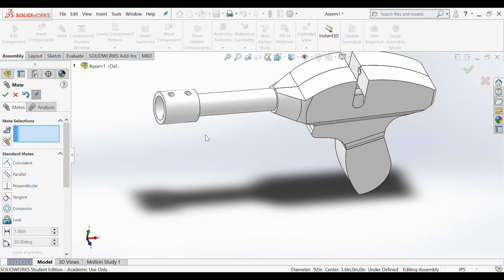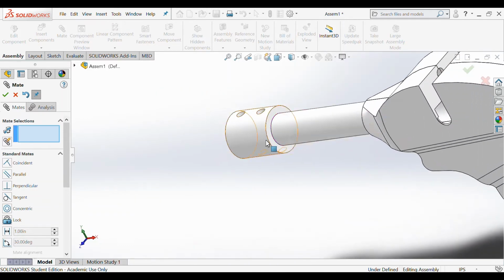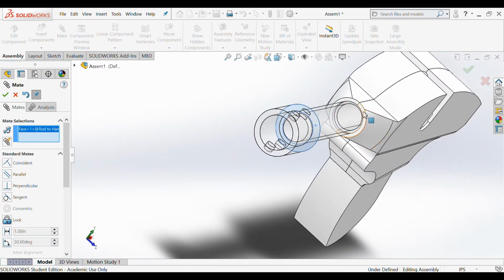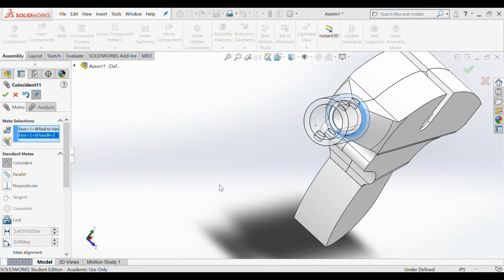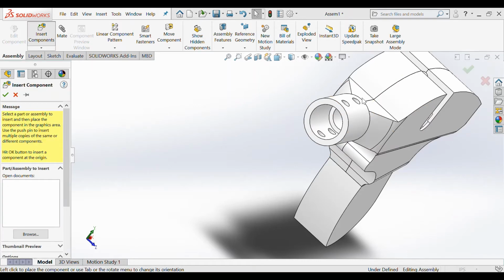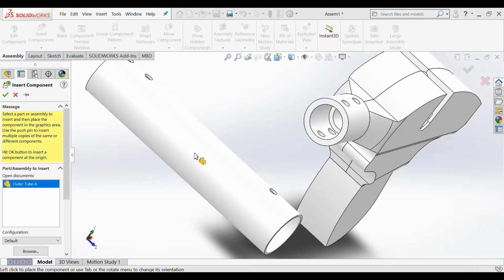And then this face right here of the part is going to be touching the piece of the handle, so we're going to do a coincident mate. And this piece is not going to be fully defined because in the end it's going to be part of our 360 rotation, so it can't be fully defined. We're now going to insert the next component, which is our outer tube. So we're going to go ahead and click there.